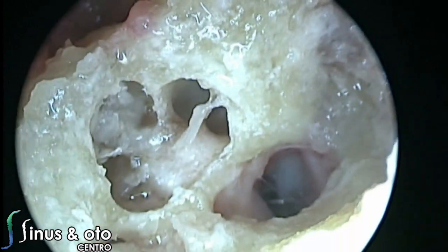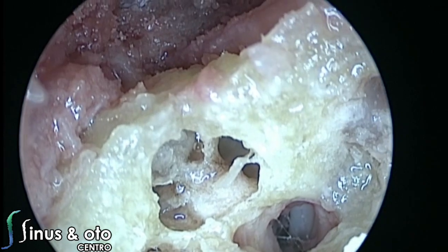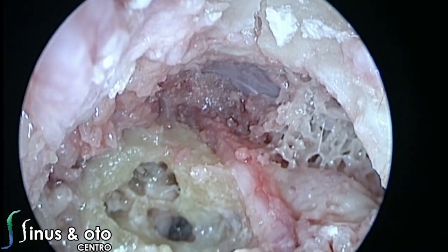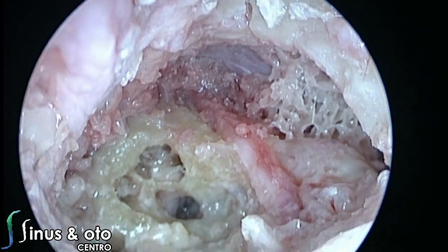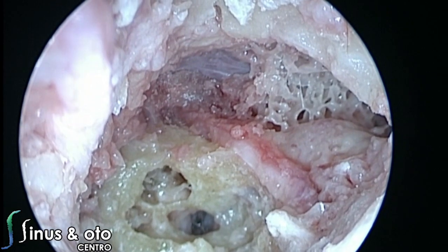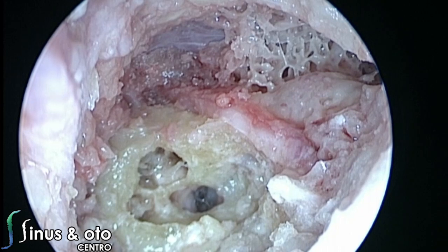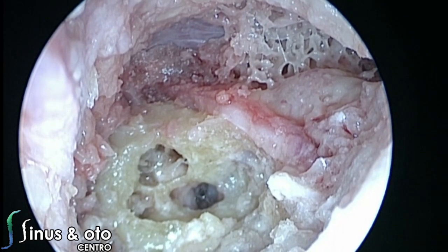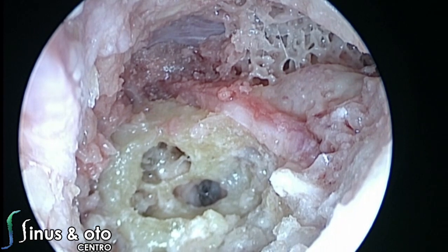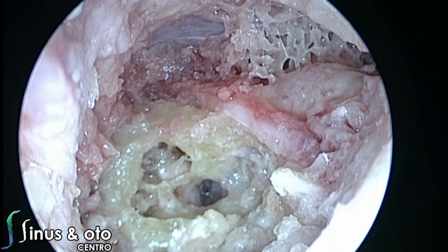So these are anatomic structures which are very nice to understand, very important to understand. And if we can understand their relationship and their proximity between the middle ear and the external auditory canal, actually the middle ear and the inner ear, we can try to understand the inner ear endoscopic approaches that we can use for some diseases that we can treat over there.